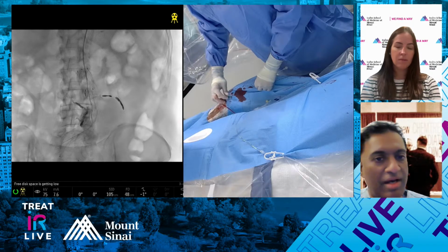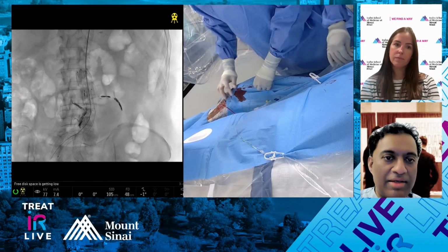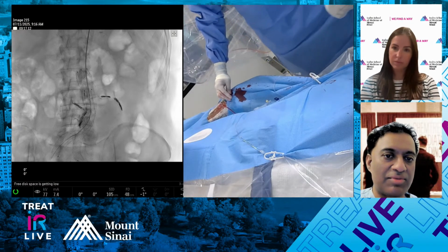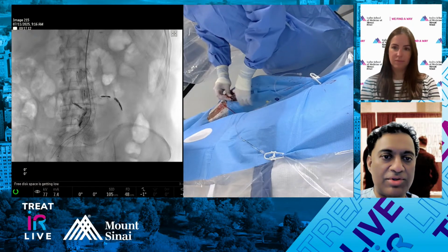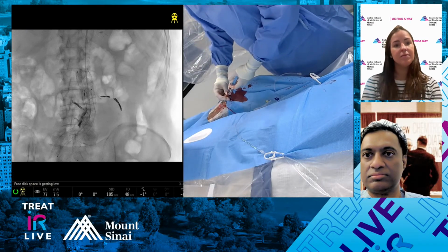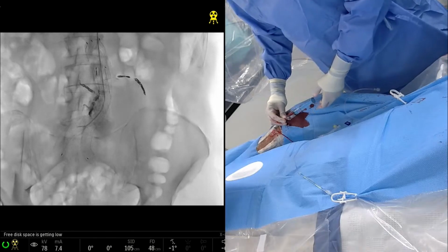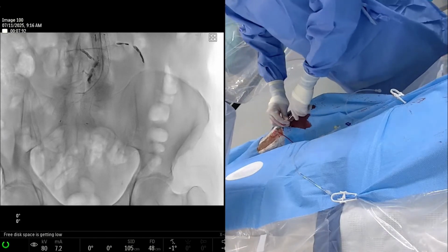One of the challenges we sometimes have in some of these thoracoabdominal cases is the tortuosity and length of the thoracic aorta. In this case, it doesn't seem too bad. But when you have a lot of elongation, there's a lot of length, unfortunately. That's what Rahul, I think, was saying earlier. I call that being taller on the inside than you are on the outside. But he's okay. So we'll do a run.